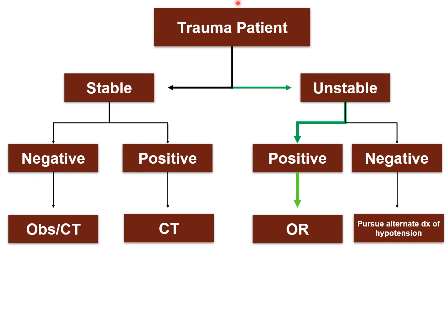But the important point with the FAST exam, and the thing that's critical to remember, is this pathway here. The unstable patient with the positive FAST exam goes straight to the OR.